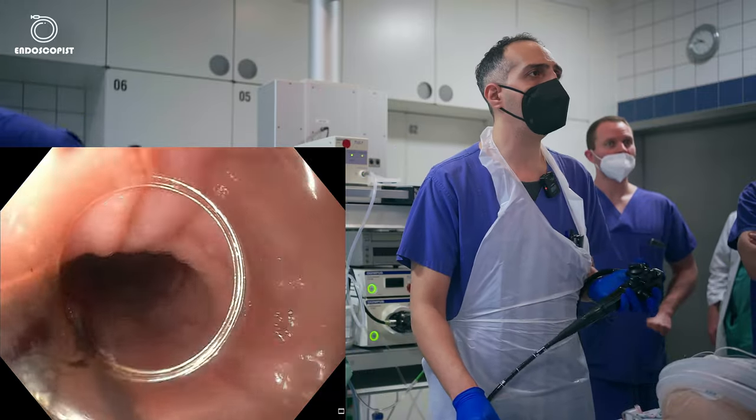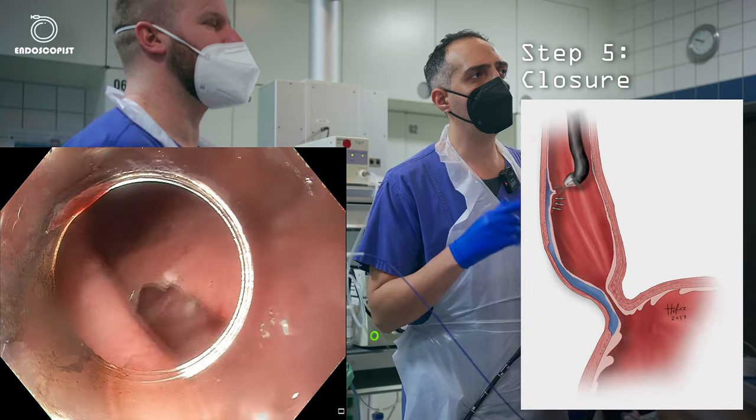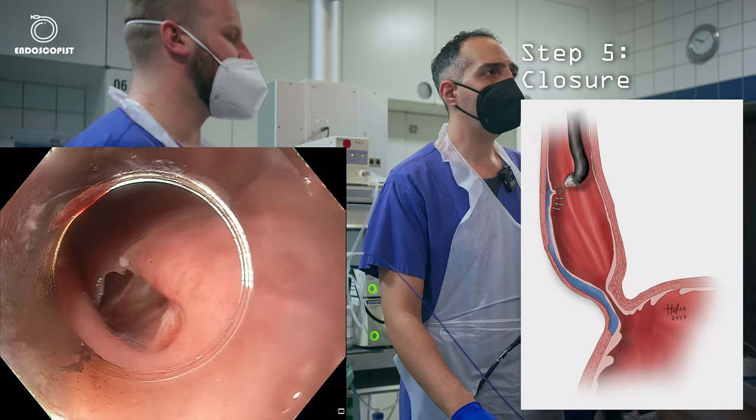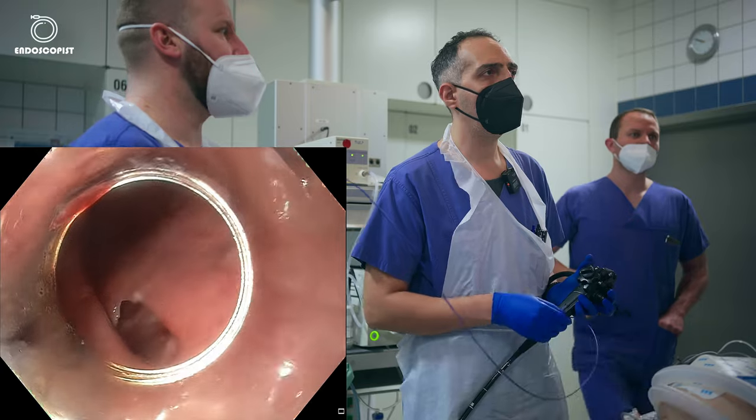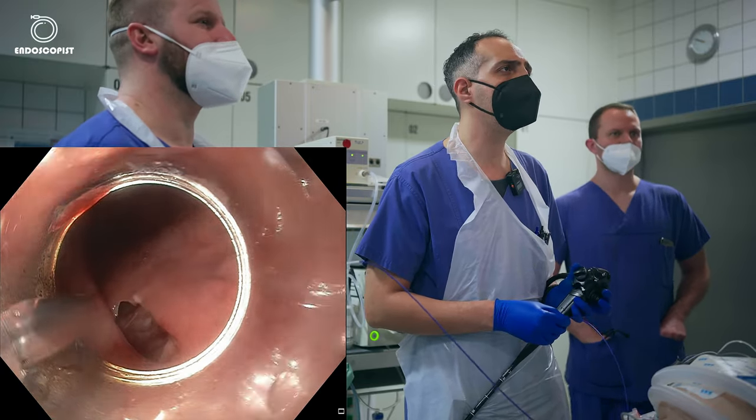And the last step now is the closure of the tunnel. It's one of the most important steps, because if you don't do it well, you have a perforation. That's why in the beginning I did a very small opening. I like to keep the incision small. Usually we need 5 to 6 clips to close it. So we will see now.